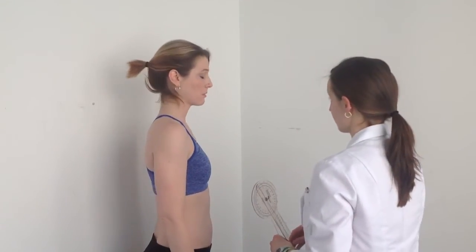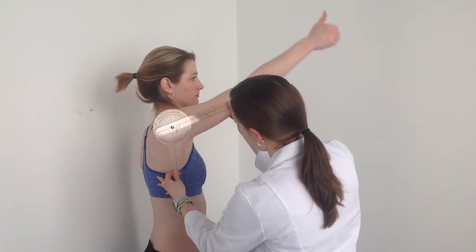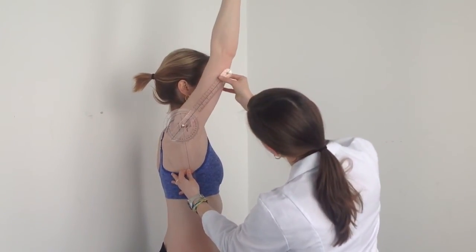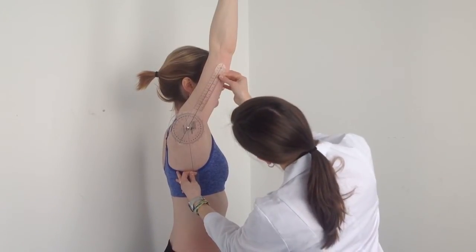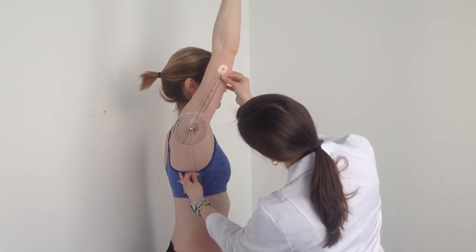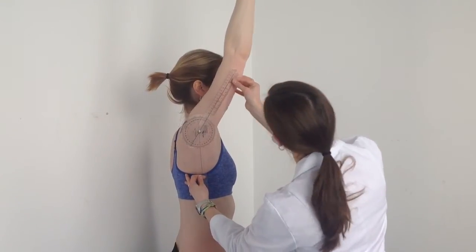Okay, so now we're going to do the same thing, and I want you to relax your arm and let me bring your arm through the motion. Okay, so that's about 146 degrees. Excellent. Okay, come back down.